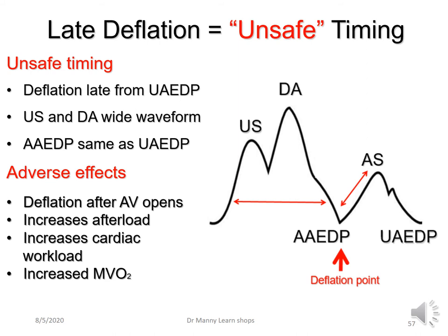It's basically the same. So the adverse effects are deflation is after the aortic valve opens. So you haven't really helped the aortic valve at all. It's already done its own work. It increases afterload because the balloon is still inflated, because the left ventricle has to push blood past the balloon, which is hard work. And this increases cardiac workload and increases myocardial oxygen demands. Unsafe timing.